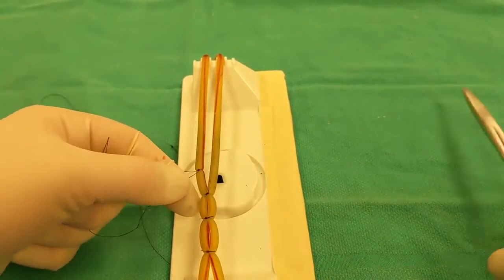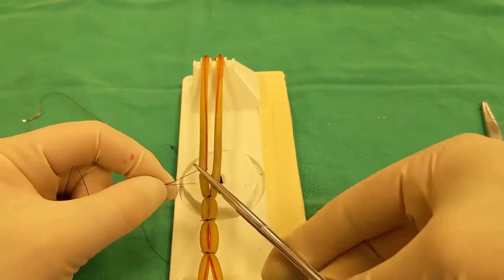And then we're going to cut these tags short. So I'll cut with the skinny side of the OR scissors down, rotate, and snip.